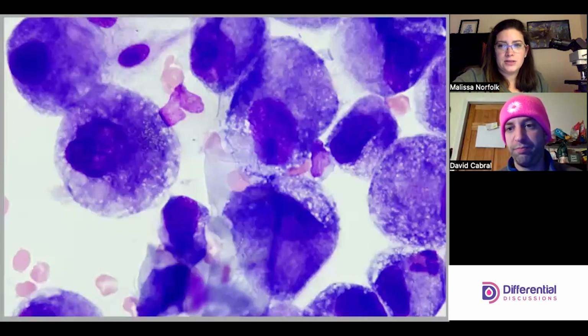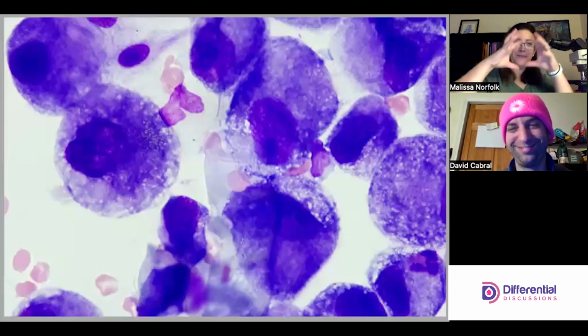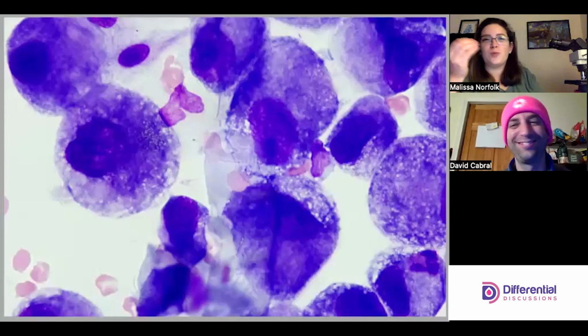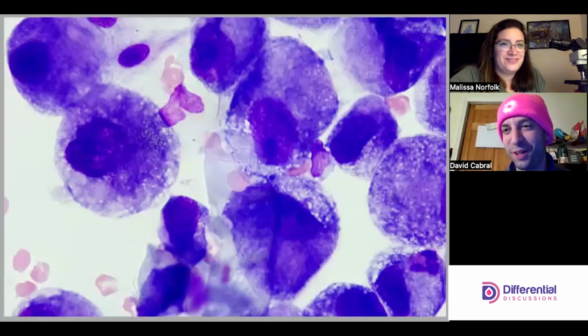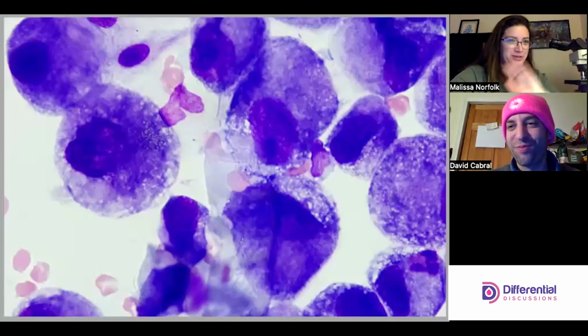Absolutely. I think this was a really good slide to look at because of all the LUMs, but especially that last one with the mesos, that little clump of mesos. Perfect. We couldn't have asked for a better end. And again, that was not planned. It was a complete accident that we found that clump of mesos.